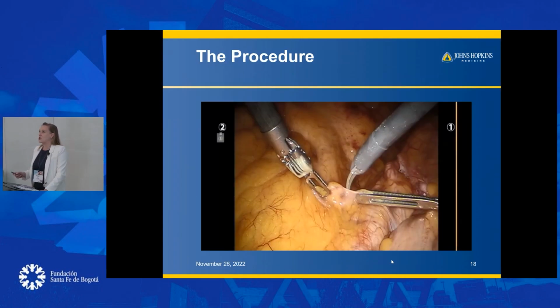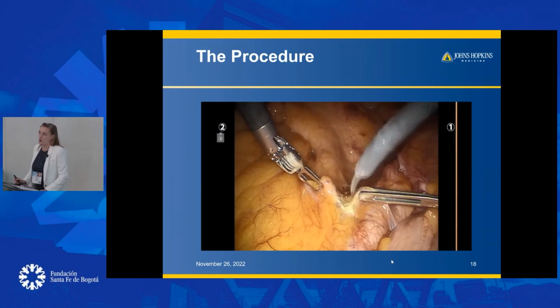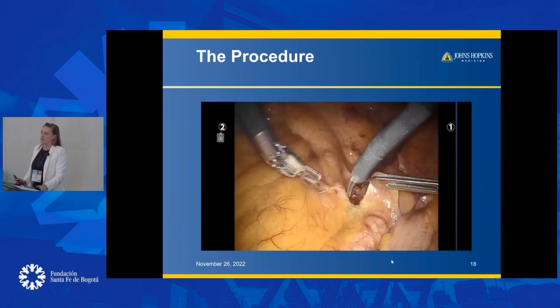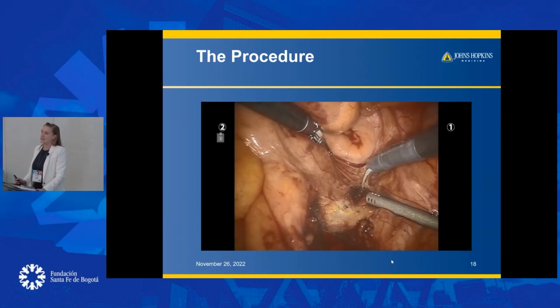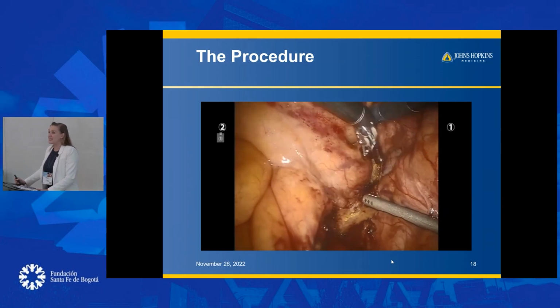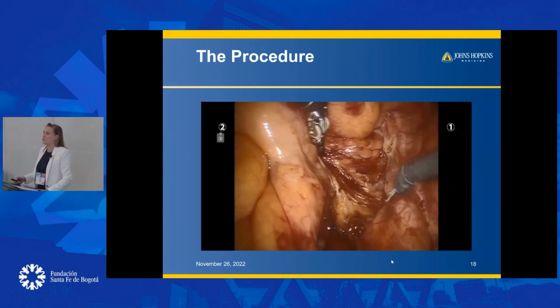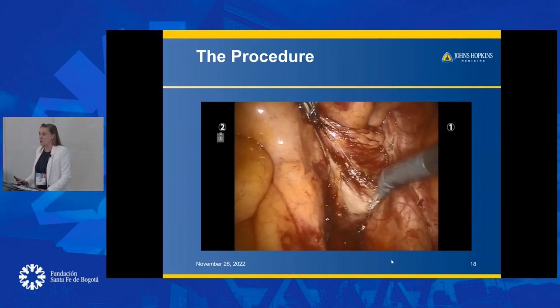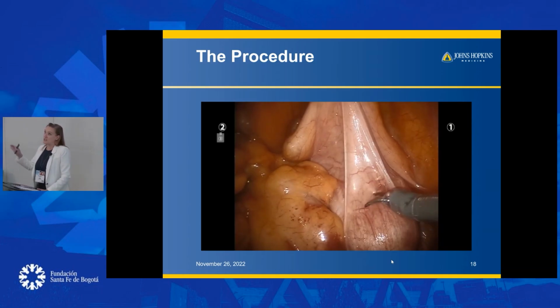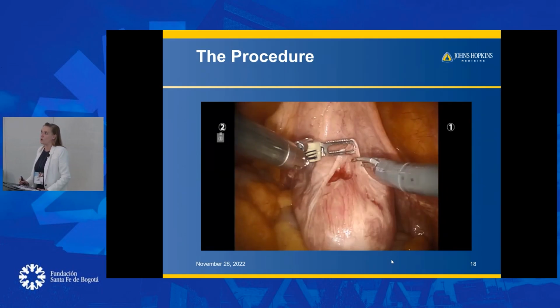So this is actually a nice video that's kind of abbreviated, and I wanted to just show everyone. This is basically right now, this is Dr. Goldman's video, but you can see he's dissecting down, or we're dissecting down to the sacral promontory. And you can see the anatomy isn't always so obvious. And then when you start to see a little bit of bleeding, it's sometimes difficult to see the sacral promontory. Now, right now, this is a post-hysterectomy patient. So this is someone we're just doing the sacrocolpopexy on.